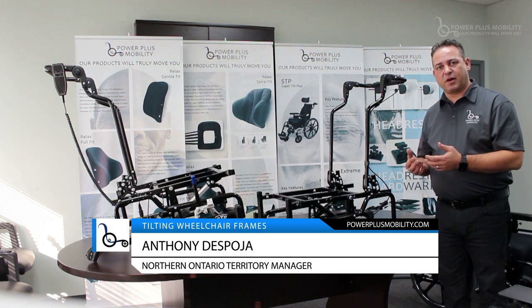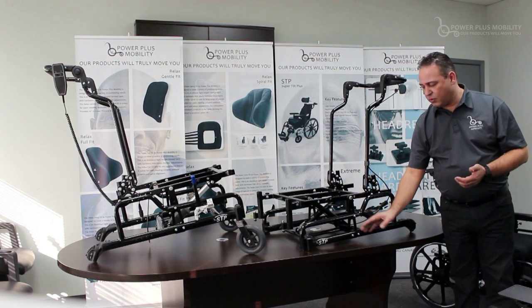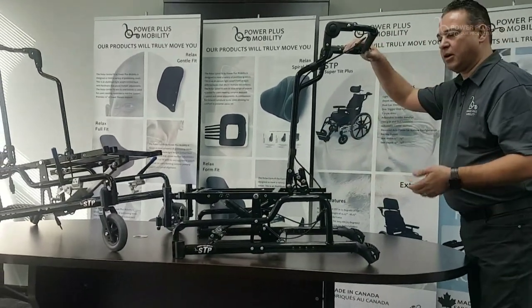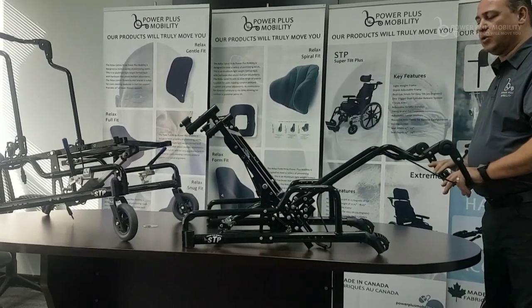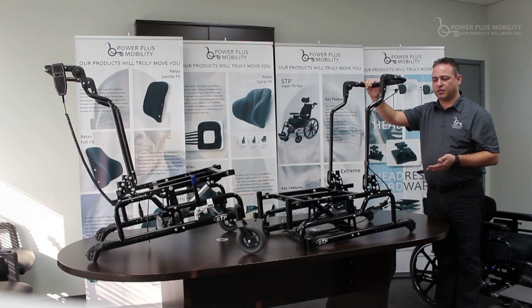Thereafter, we have an upper assembly frame. The upper assembly frame is attached by a plate in through here, which is reinforced. It has two pivot points, which allows for our tilt chair, or STP, to tilt to 55 degrees. Most tilt chairs on the market have 45 degrees of tilt, but we have the range of going from 0 to 55 degrees of tilt.